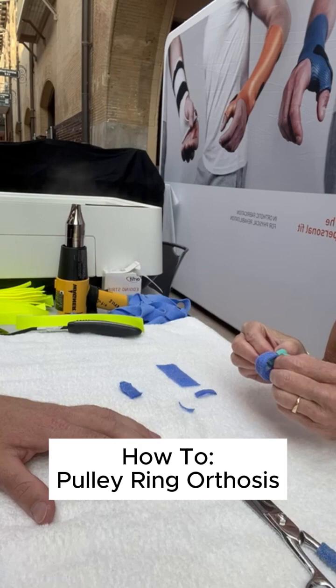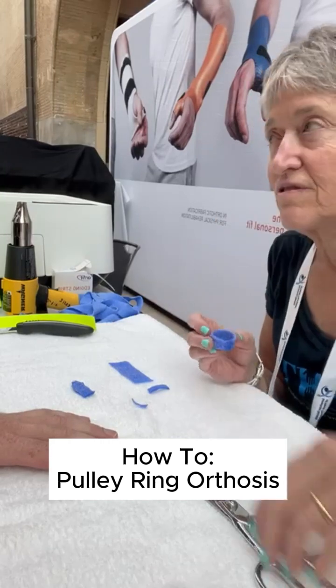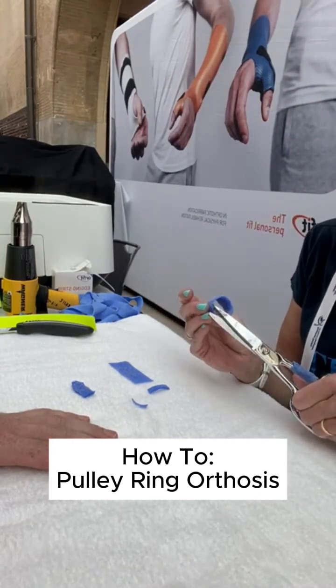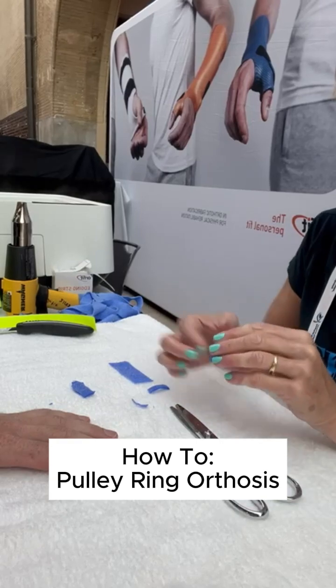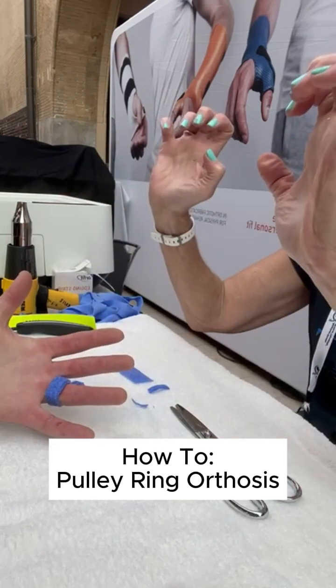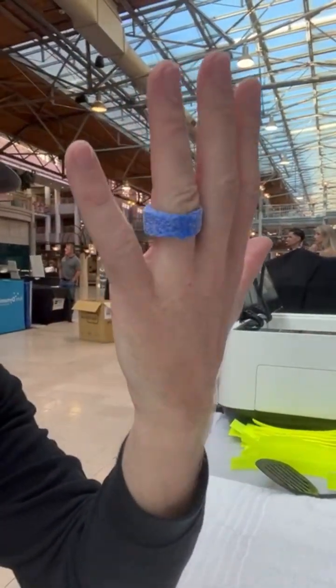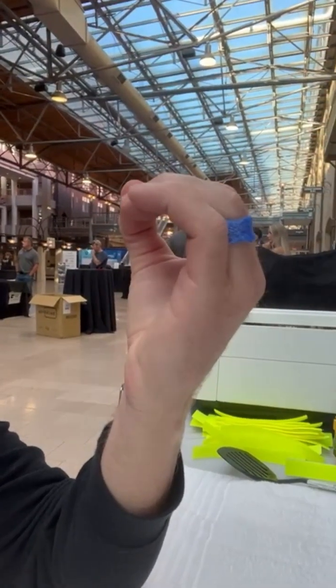What you're really afraid of is degloving injuries where the ring gets caught and pulls the skin off. I'm just going to set this on — it's going to go this way. You should be able to do your crimp in front of it. Let's go on this side — show the front and the back, and do the hook position. That's our pulley protection with Orphecast.